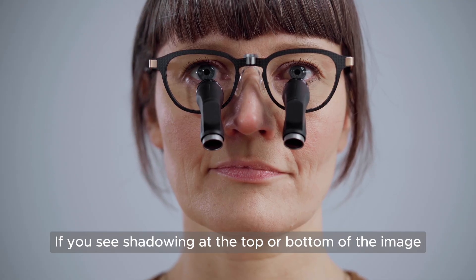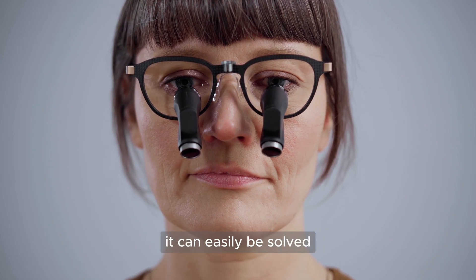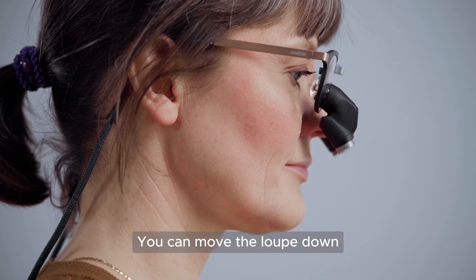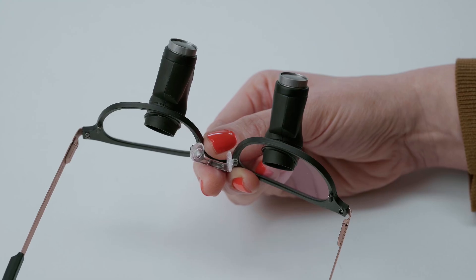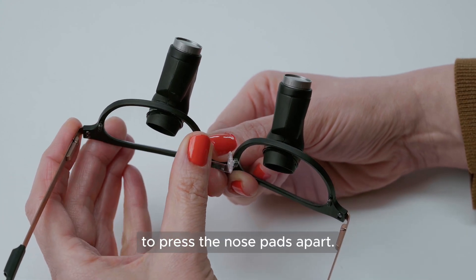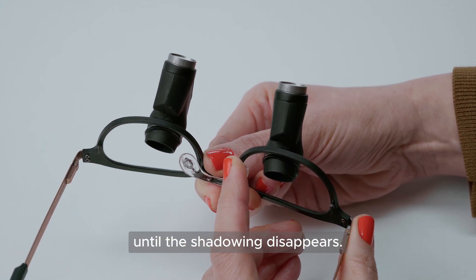If you see shadowing at the top or bottom of the image when you look through your Reflect, it can easily be solved by adjusting the height of your loop in relation to your eyes. You can move the loop down by widening the nose pads. Hold the frame firmly at the nose bridge, and use your thumb and forefinger to press the nose pads apart. You may need to adjust a few times until the shadowing disappears.